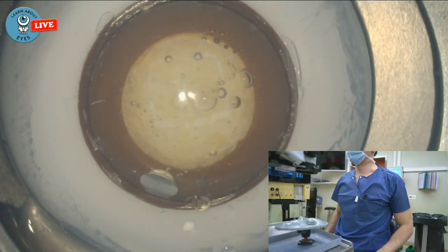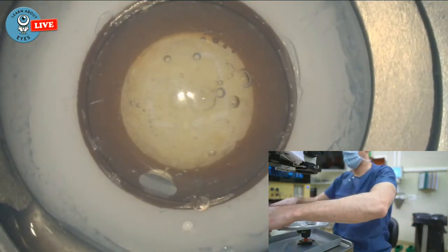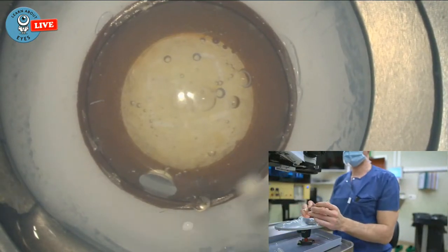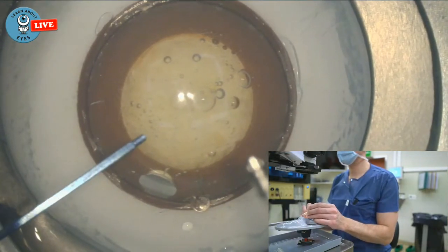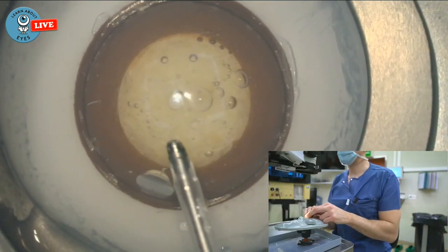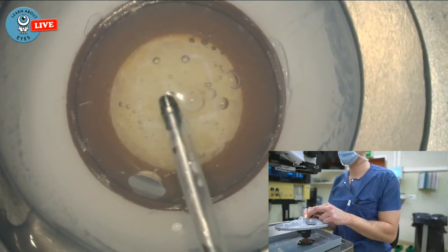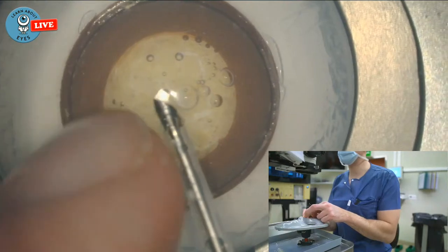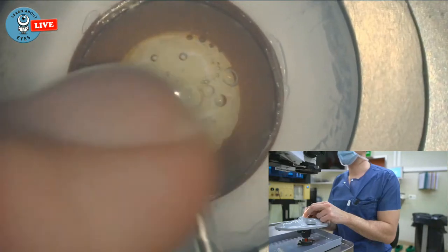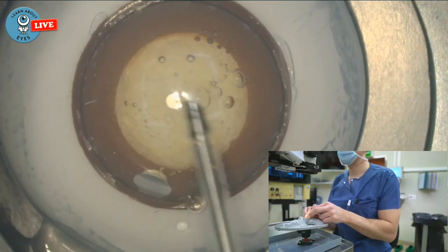Okay, so now it should be time for Phaco. Let's use this second instrument. It's pretty dirty, you can see. Now with this, you want the two holes to be on the sides. So depending on how you're gonna hold your Phaco tip, if you're gonna hold it like this, it should be left and right. Now, if you're gonna hold it like this, which is what I'm gonna do, it should be here, left and right. So this is not correct. Like this should be fine.